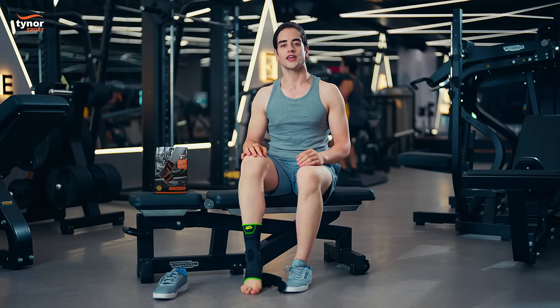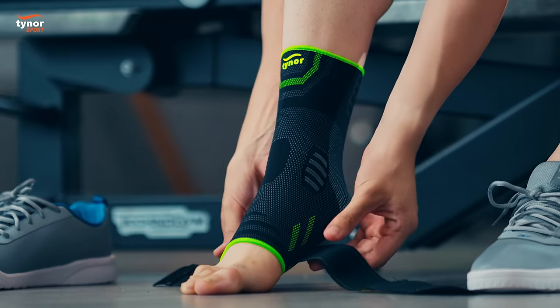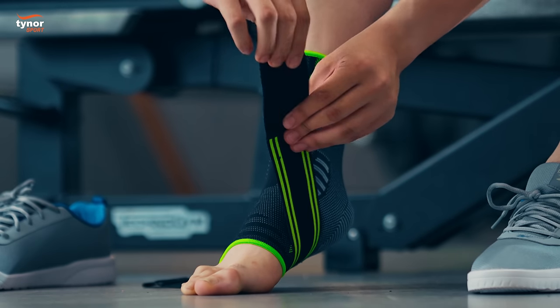Make sure that the heel snugly fits in the accurate position. Wrap the strap around the ankle in a figure of eight manner.